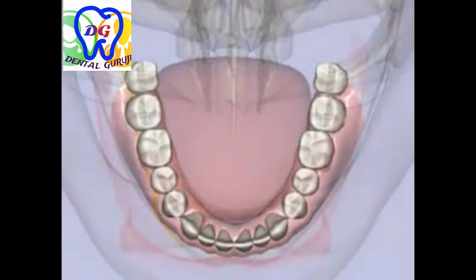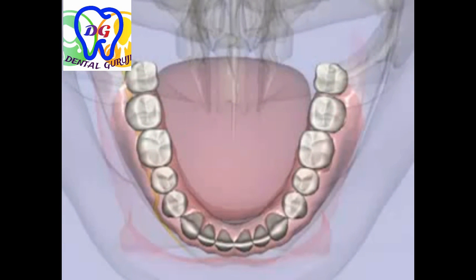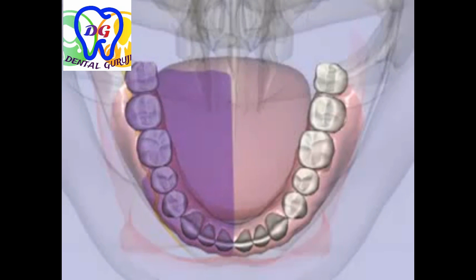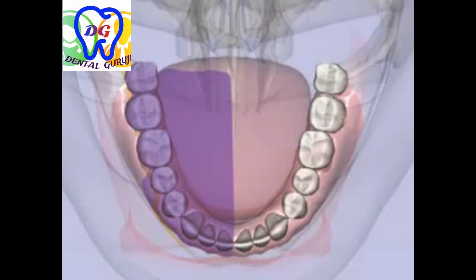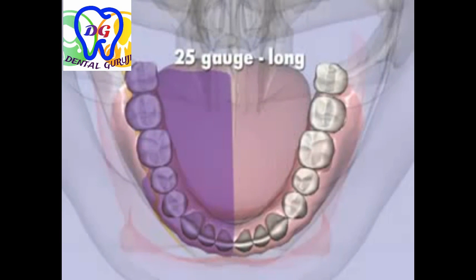The inferior alveolar nerve block provides anesthesia to the pulps of the mandibular teeth in that quadrant, the buccal soft tissues and bone anterior to the mental foramen, the anterior two-thirds of the tongue and the floor of the mouth, and the lingual soft tissues and periosteum. A 25-gauge long needle is recommended.